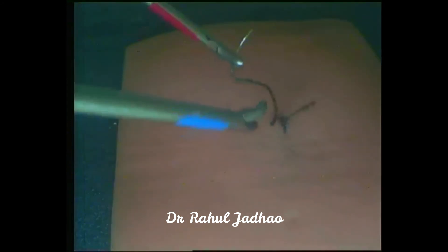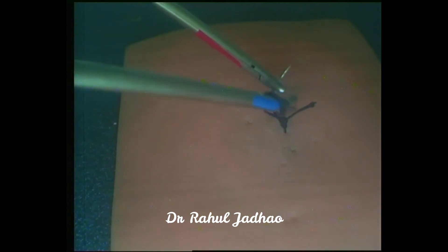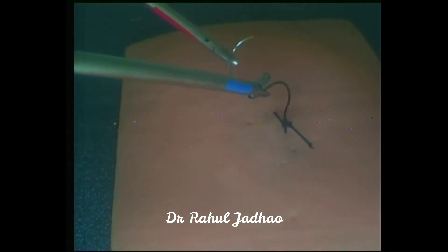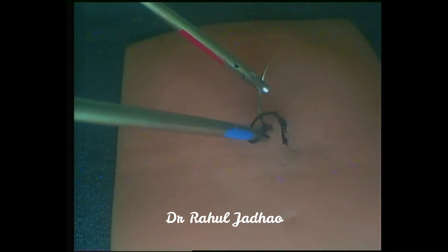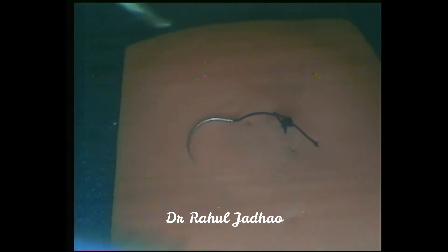One has to take care that when the needle is positioned on the needle holder, it is an active needle and it can injure any nearby structure.